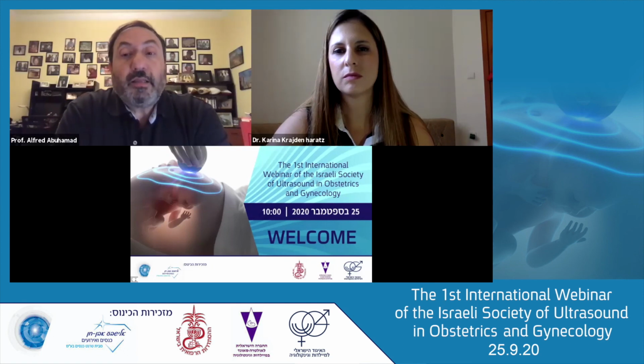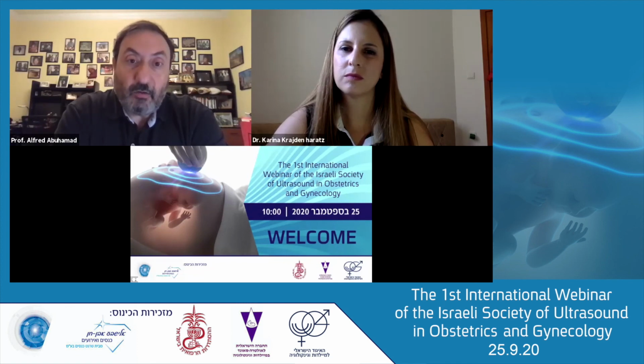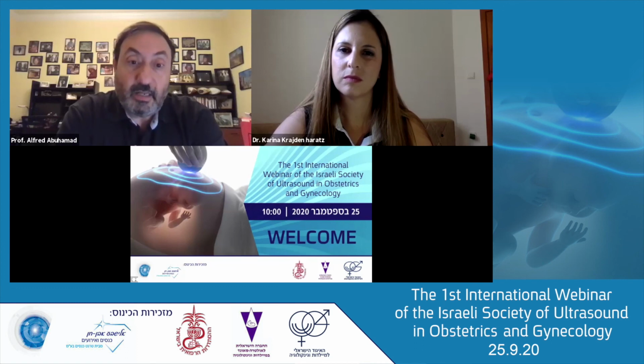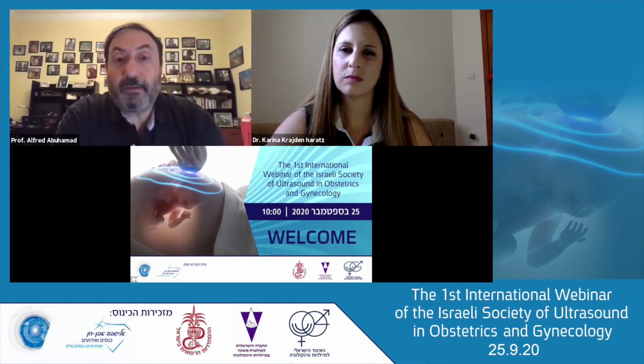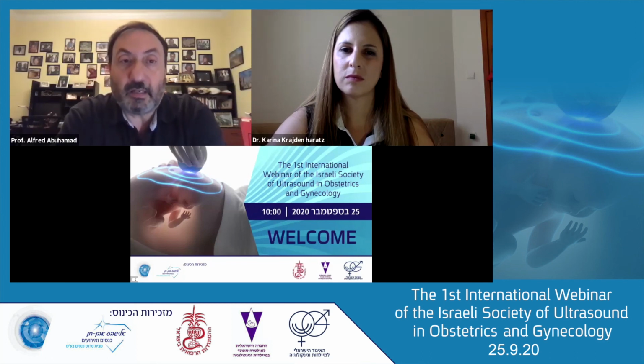If you are in the habit of looking at the brachiocephalic vein, as Dr. Shawi had shown today, by sliding up into the chest, an absent brachiocephalic vein should always be a strong marker to the presence of a persistent left superior vena cava and then a dilated coronary sinus, because that's the most common association when there's an absent left brachiocephalic vein.